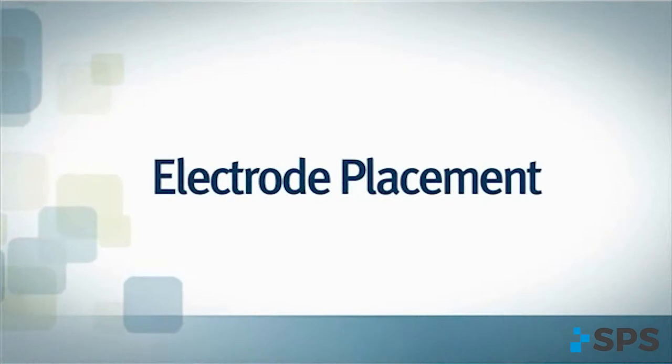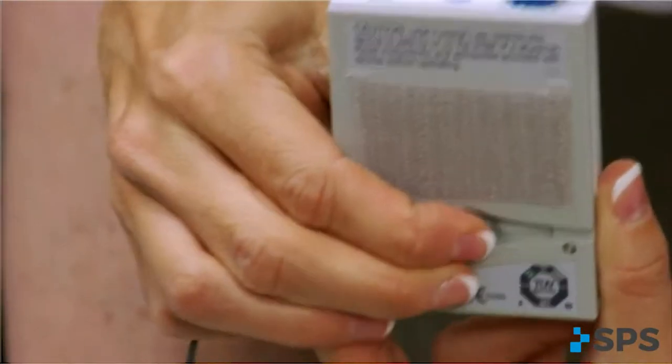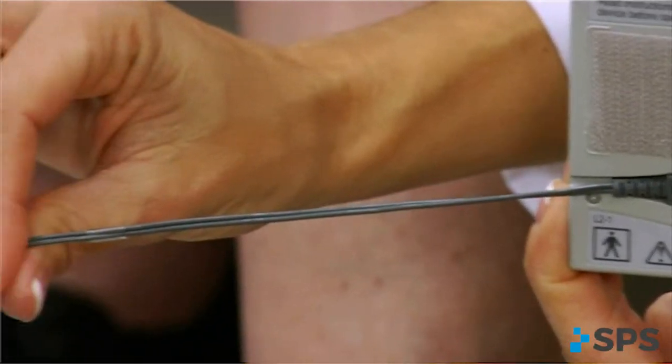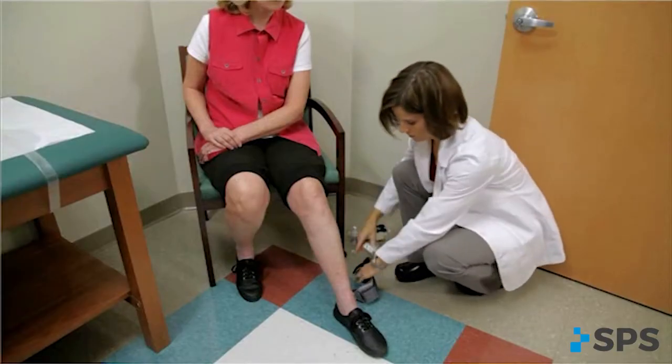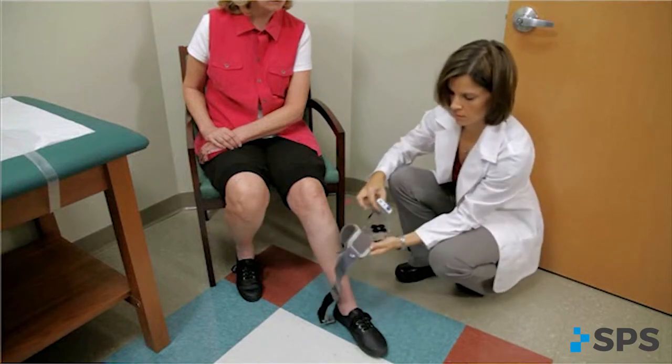The higher water content in both sizes of premium blue gel electrodes promotes safe and effective stimulation and may be gentler on the skin. Alternative electrode options are still available for patients who have done well with them in the past. Make sure the walk aid is turned off and attach the electrode lead cable to the back of the walk aid, running the cable to the right for a right leg and to the left for a left leg. This allows plenty of cable length and prevents excessive bending or flexing of the electrode lead cable.